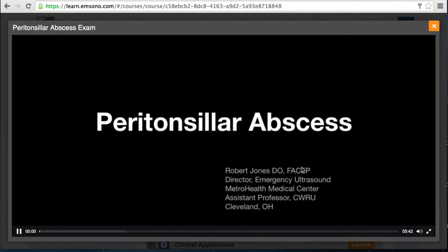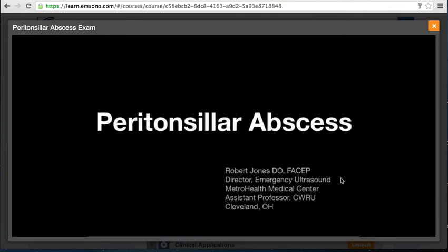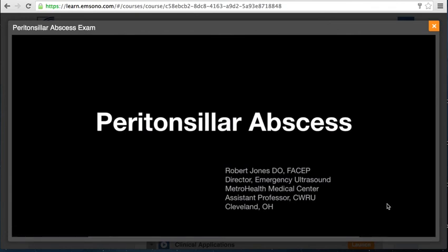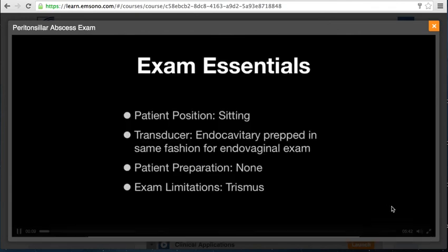Dr. Robert Jones, and in this lecture we're going to go over the sonographic evaluation of peritonsillar abscesses. Let's go over the exam essentials.